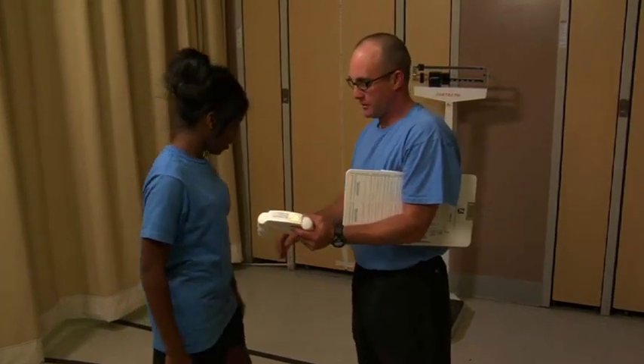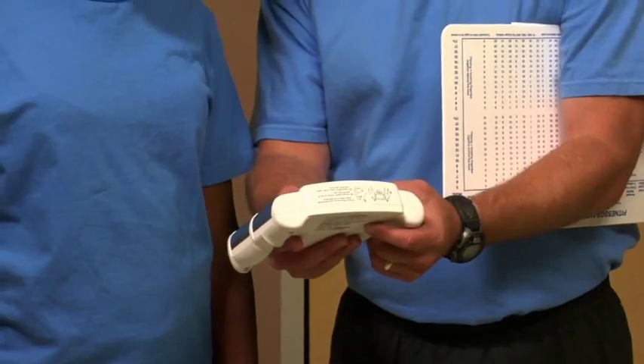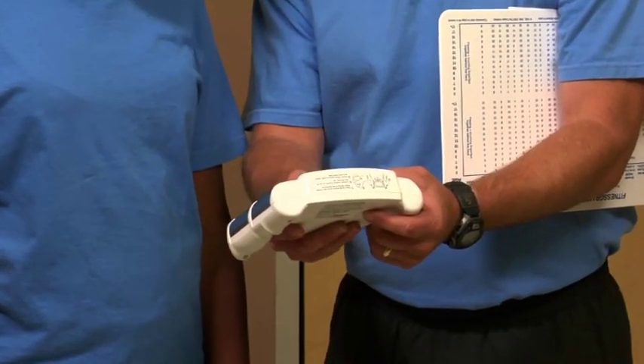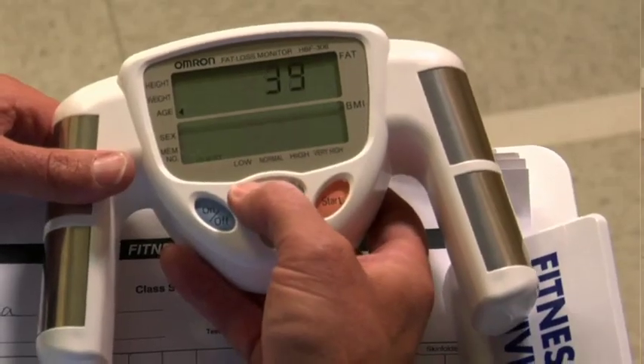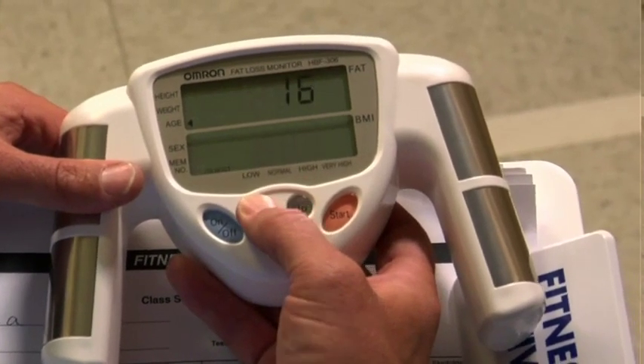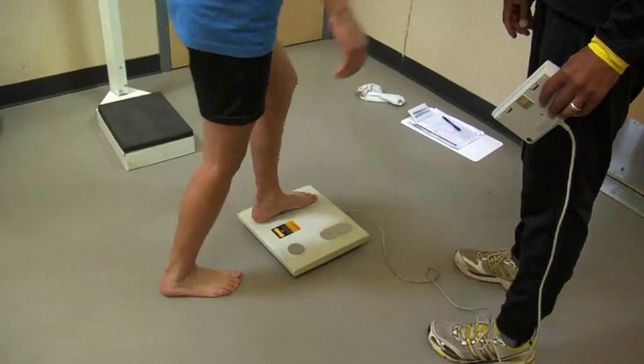Bioelectric Impedance Analyzers measure the resistance to the flow of an electrical signal in the body. The device sends a safe, low-energy electrical signal through the body and generates an index of resistance. The device is programmed to use this resistance value along with other values such as height, weight, age, and gender to estimate the percentage of body fat.